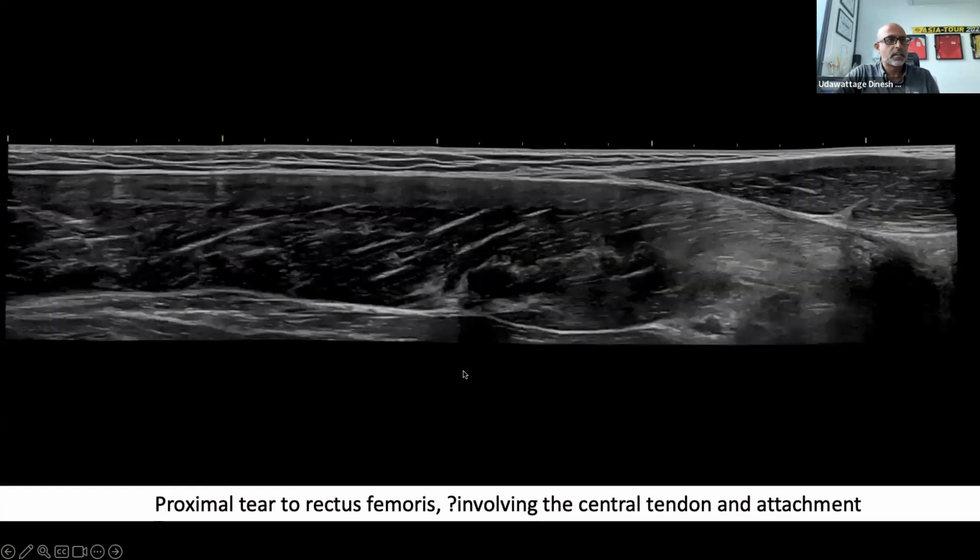And if you look at it in the long axis orientation, at the bottom here on the left of the image we're heading towards the knee, at the right we're at the hip, and you can see the muscle belly here, and it's nice and dark. There's plenty of fluid, and it's looking very healthy, nice pennation angle and everything to the muscle.